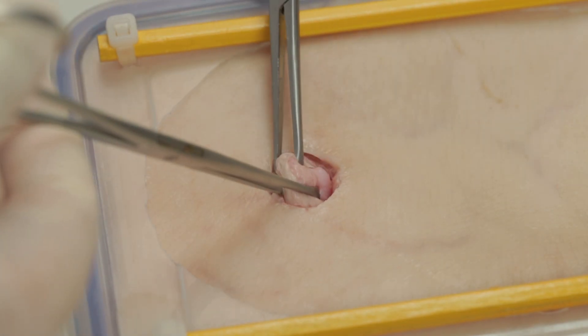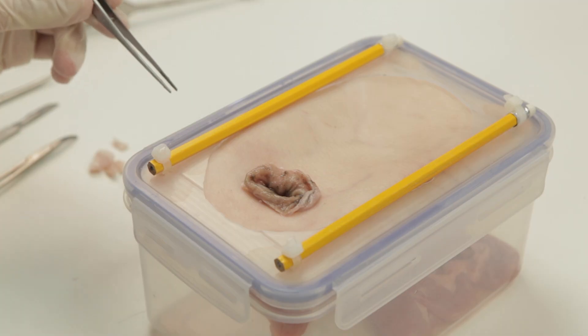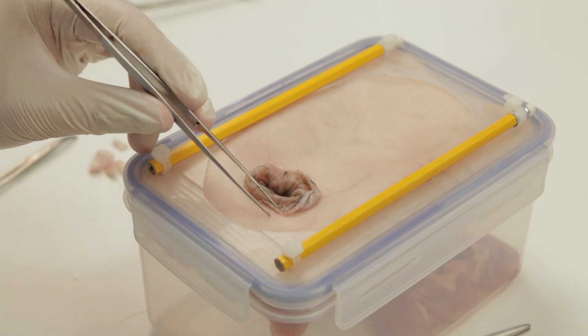We will commence by demonstrating a colostomy. Normally, the end of bowel being pulled through would have been sutured or stapled; however, for the purpose of this demonstration, it has been left open.